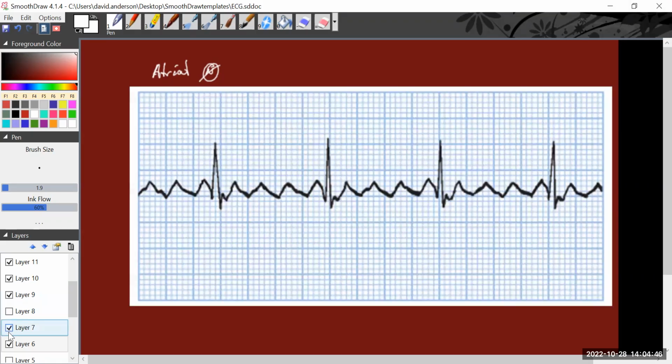So here we're looking at what's described as a sawtooth pattern. You can see here that we've got multiple atrial contractions between the ventricular contractions. So the atrial activity is overriding any repolarization. In this sample here, we've got 1, 2, 3, 4 P waves before one QRS complex. Now, the QRS complex remains relatively equal, so cardiac output is probably not unduly affected in this example.